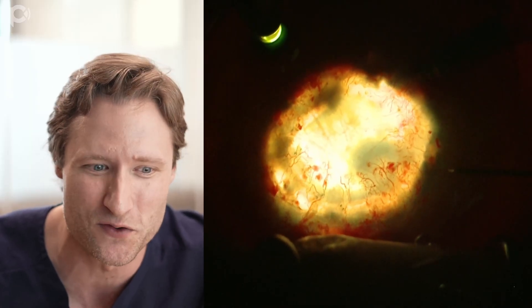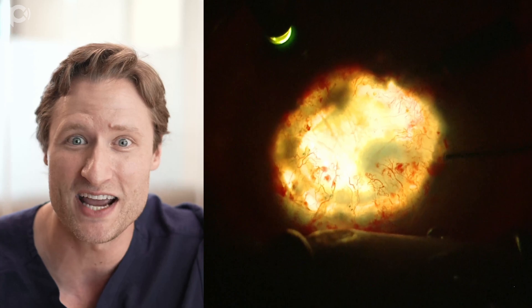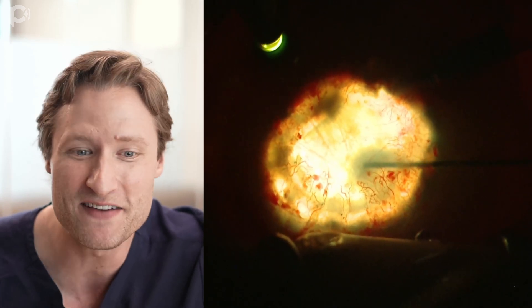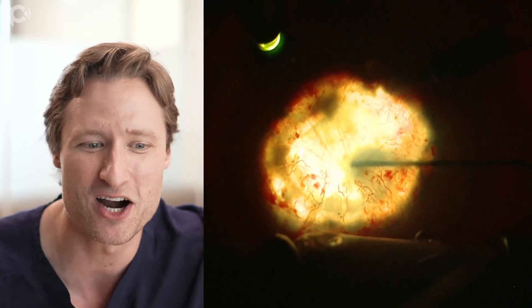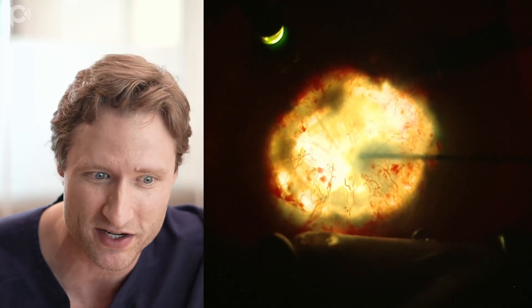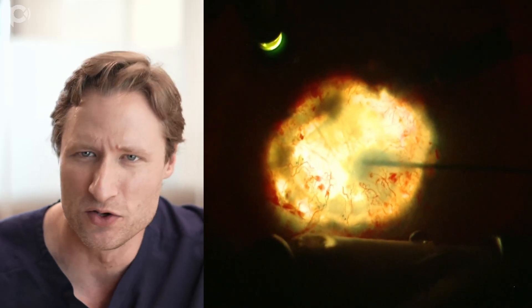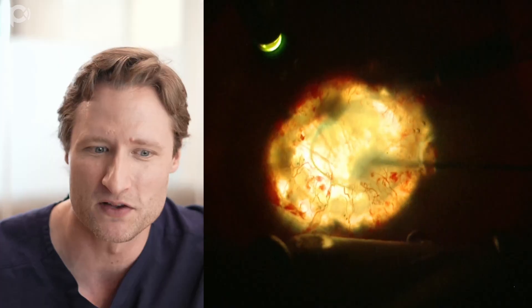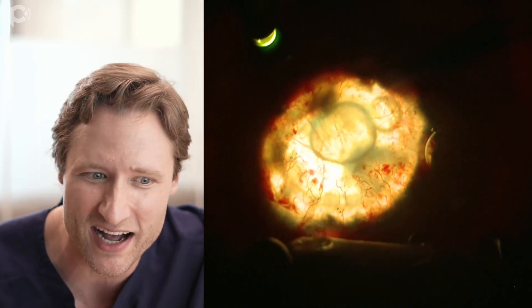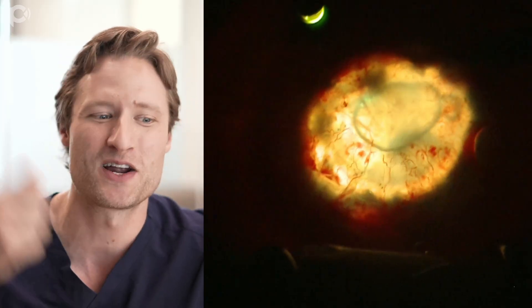And there it is, completely unfolded in the eye. I still have the anterior chamber maintainer going. So what I'm going to try to do is lift the graft by putting an air bubble underneath it. Here I'm trying to lift the graft with an air bubble, but the entire chamber doesn't inflate - I'm only successful putting this little bubble in the eye. So it's time to remove the anterior chamber maintainer.